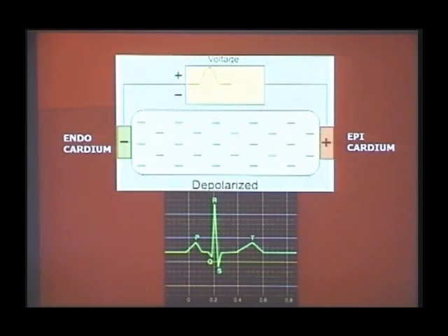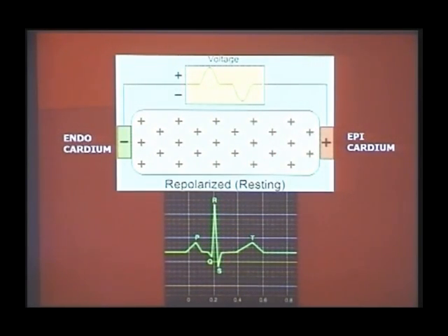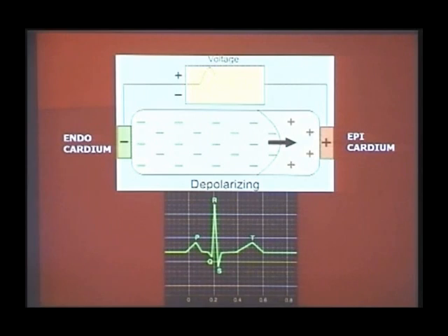Have you seen an ECG sometime? No? So whenever you see an ECG, the QRS represents the ventricular depolarization and the T wave represents ventricular repolarization. So now we translate this repolarization into an ECG waveform. The QRS complex is depolarization, T wave is repolarization. That means during the depolarization, during the QRS complex, outside cell becomes negative. During my T wave, outside cell becomes positive again. So that's what we have seen.